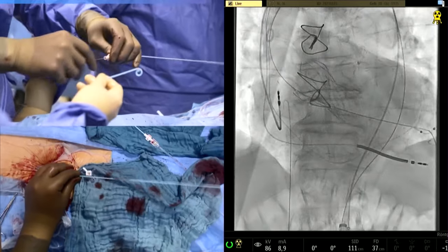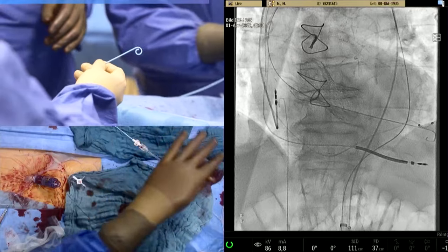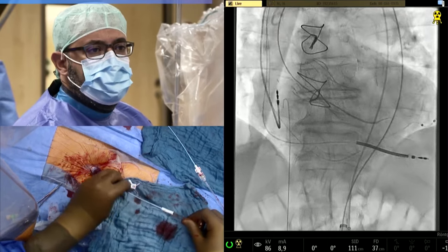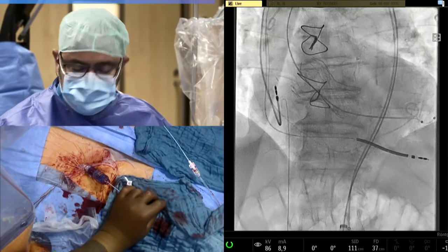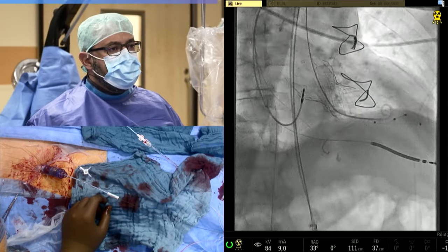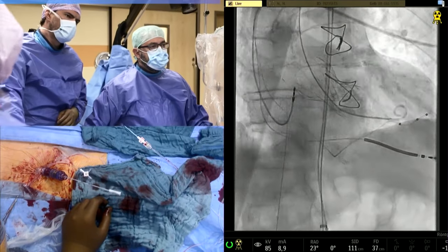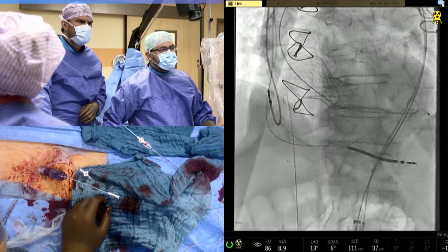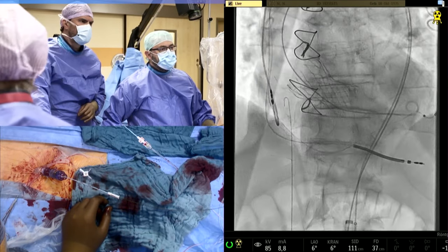And we're now going to place our pigtail. I think the movement of the catheter, yeah, the wire is also quite liberal. Yes. It goes more or less smoothly. And we just leave the wire for a second, Philip, to make it more visible. And then we'll just go around and see in different views. You can see here that it appears to be inside the stent frame throughout its course, so it doesn't exit and re-enter again, which is very important here. So you can see here, we are inside the frame.